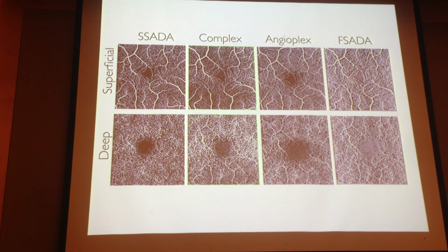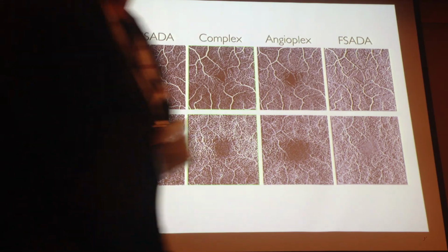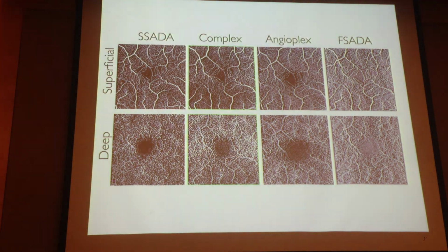Okay, are there any other questions? In terms of masking, I'm wondering if the retina is very thickened due to fluid, for example, in diabetic edema, or in cases of AMD with exudative, leaking material, would it affect the structure that we see?